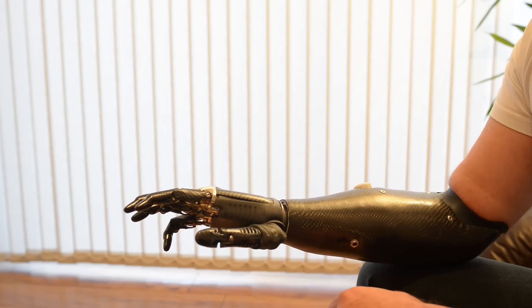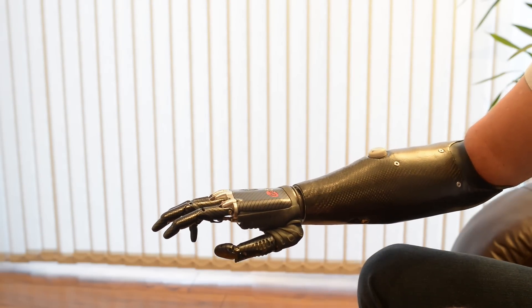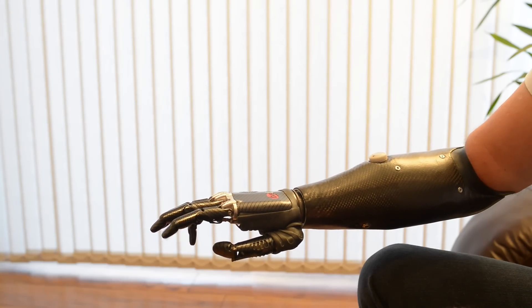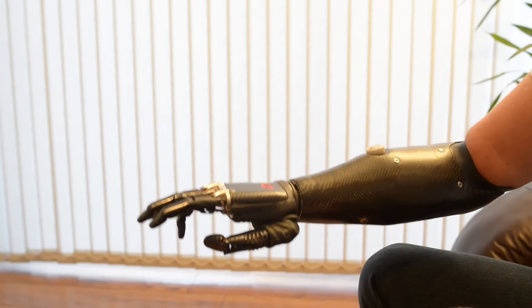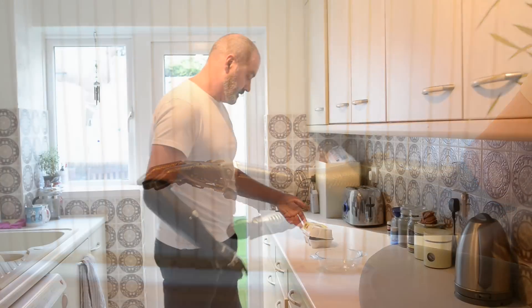And then we have a mouse grip. This will hold a mouse, single click, double click. And they're developing this now so that you'll be able to, soon you'll be able to drag and drop.